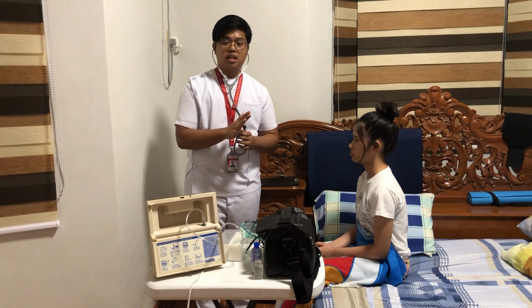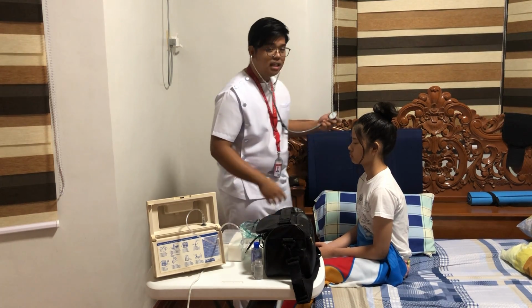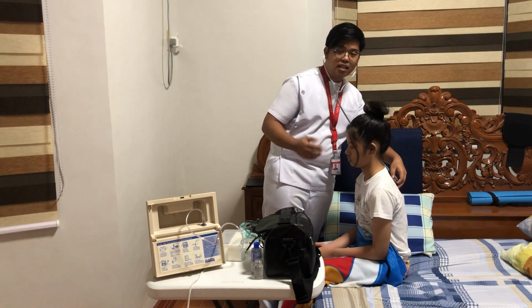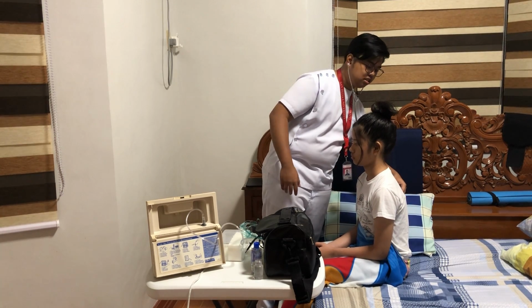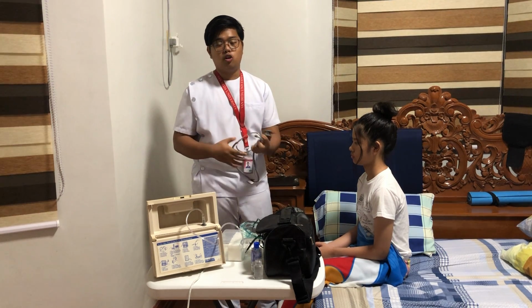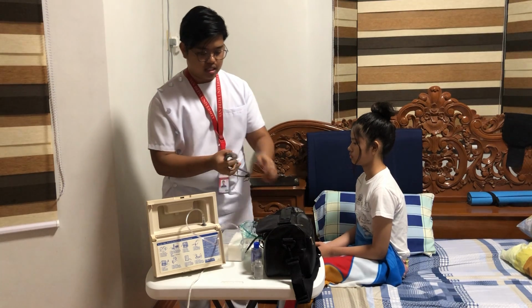So again, we need to warm the diaphragm and then begin the auscultation. So again, it's just the same pattern, breathe in, breathe out, following the proper pattern of auscultation in the lungs. And then after that, we must remember to take down note of any changes that we have noticed.